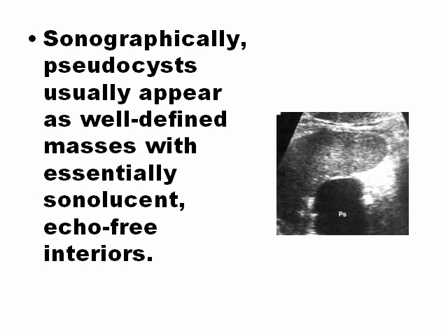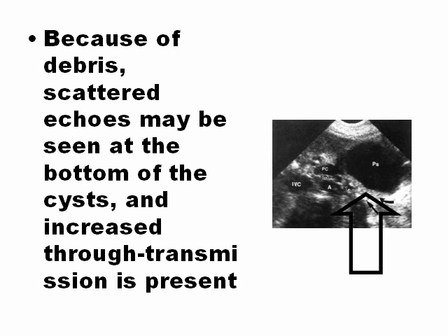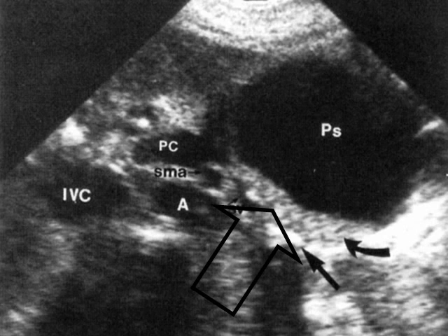Sometimes pseudocysts appear as a well-defined mass with a sonolucent interior. You can see here a pseudocyst that is totally anechoic. But sometimes there are debris that can produce echoes in the bottom of the cyst, and increased through-transmission is present. Remember, these are not real cysts — they are pseudocysts. In the picture you can see in the bottom of the pseudocyst the tissue debris that are echogenic.